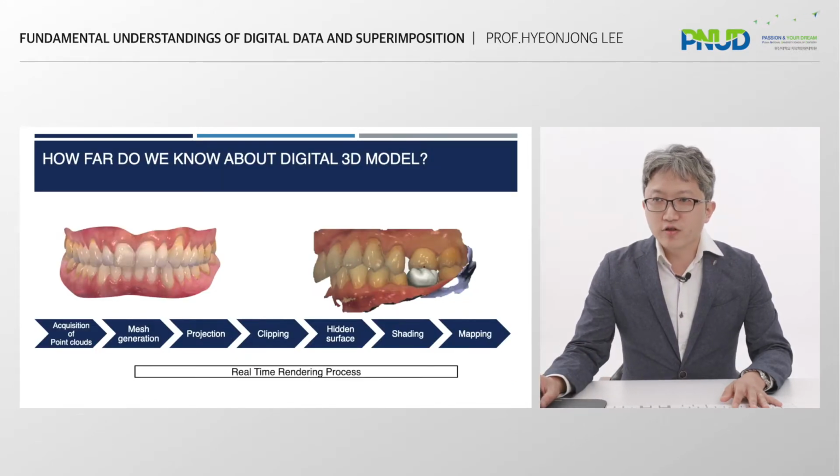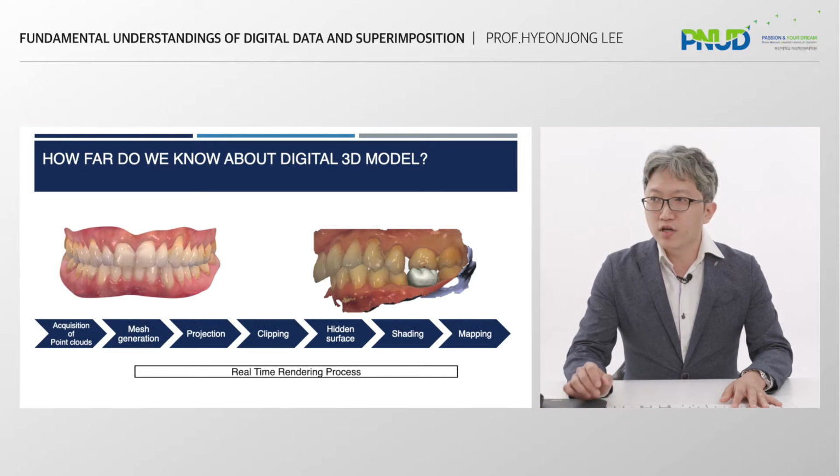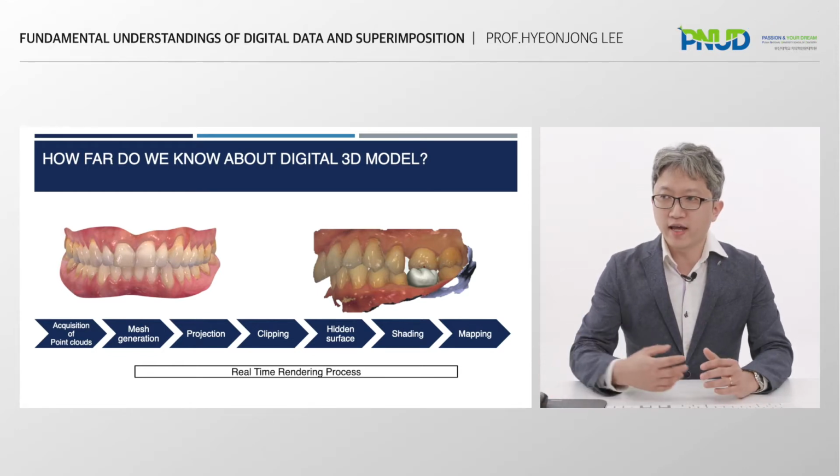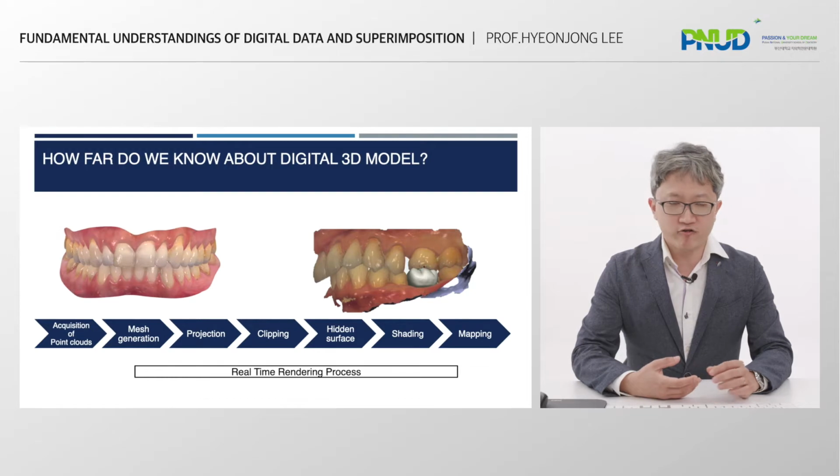But how far do we know about the digital 3D model? When we use an intraoral scanner, it shows only a nicely rendered 3D view. It just looks nice. As you can see in this slide, there are many steps of workflow before we obtain a good-looking 3D intraoral image.